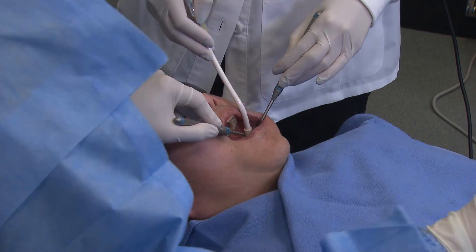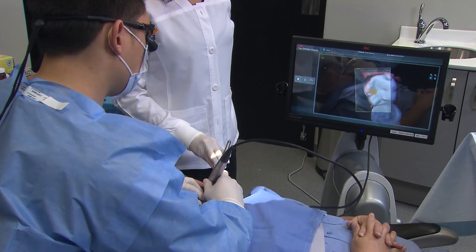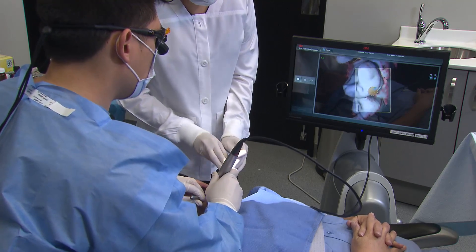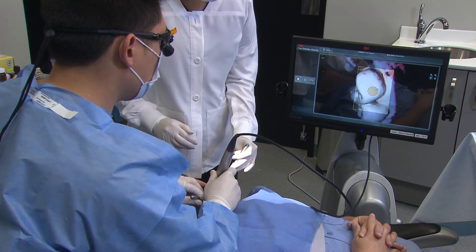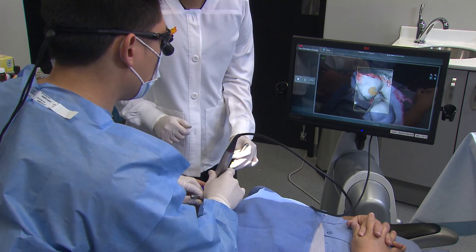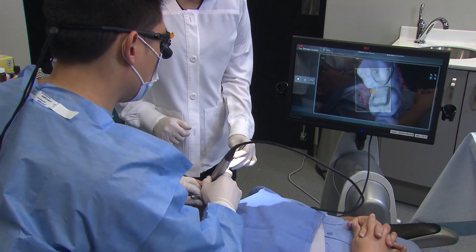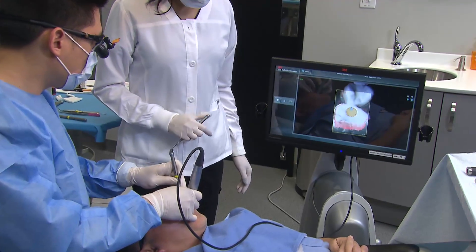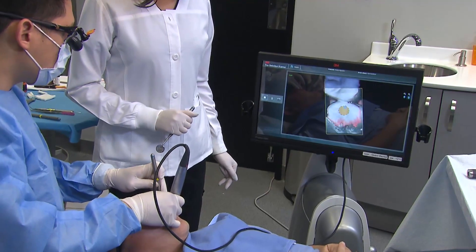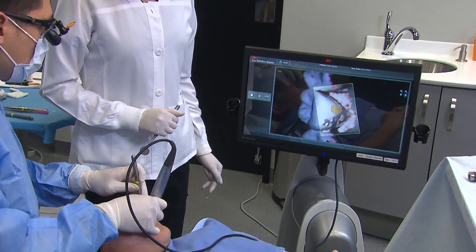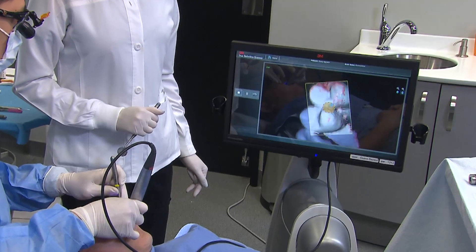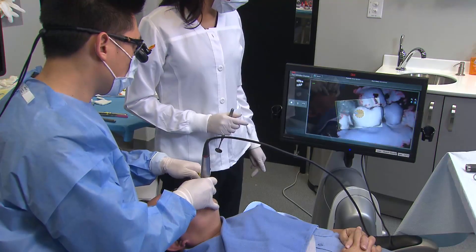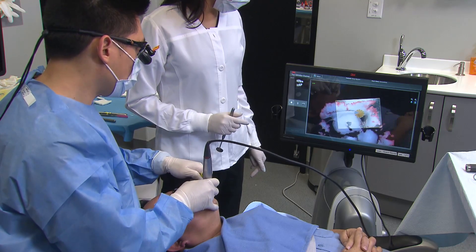No retraction cord was necessary because the margins were kept supragingival. For the preparation scans, I ensure that all surfaces are captured — occlusal, buccal, and lingual — rotating almost to 90 degrees on both sides to ensure those areas are well captured. Then on to the opposing scans, where we also want the functional areas along with the entire buccal surface, because that will align during the bite scans when the patient bites together.